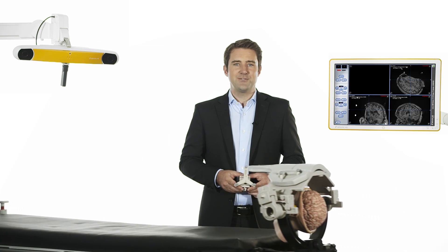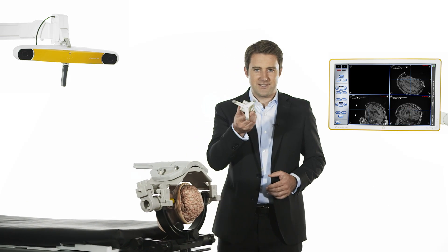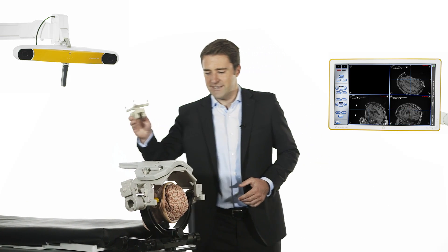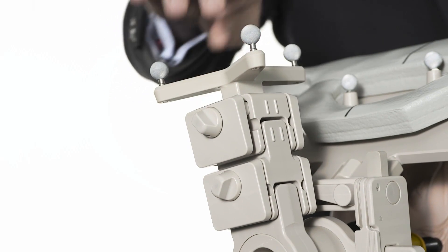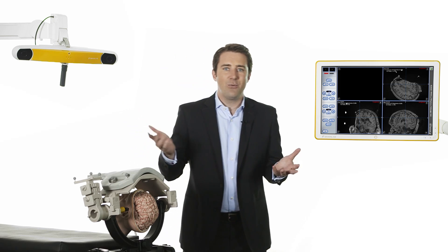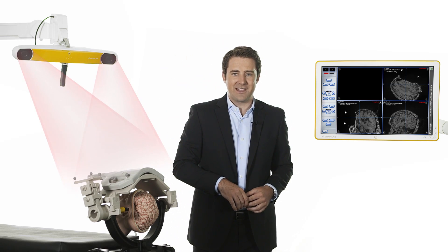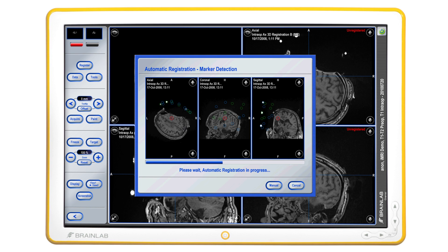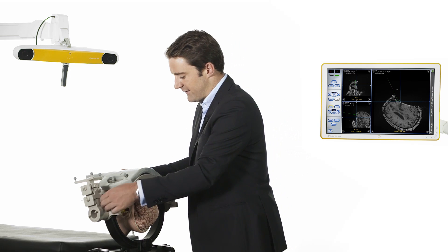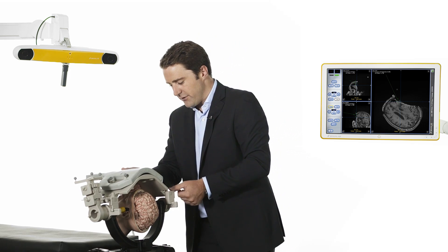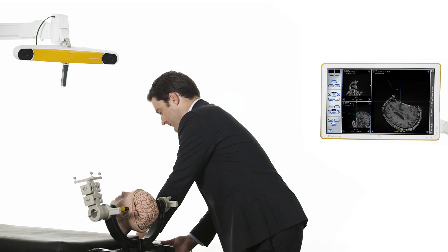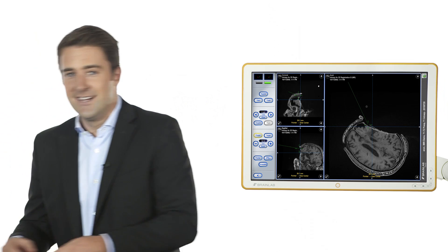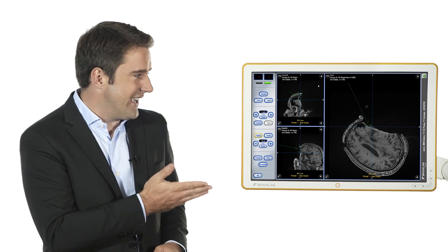When the patient returns, the drape link reference array is reattached. Now with matrix and array visible to the camera, the software completes the registration. To continue surgery, the coil and matrix can be removed. Now the data is ready for navigation.